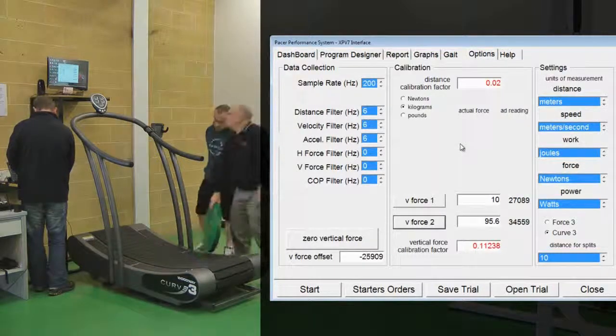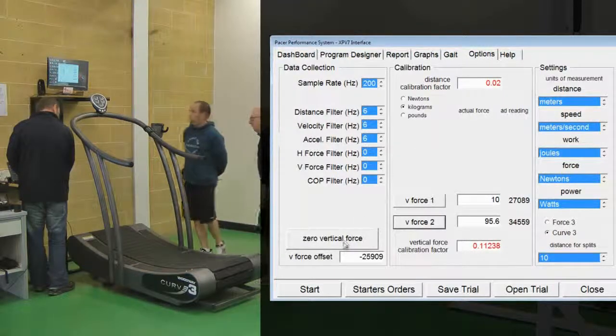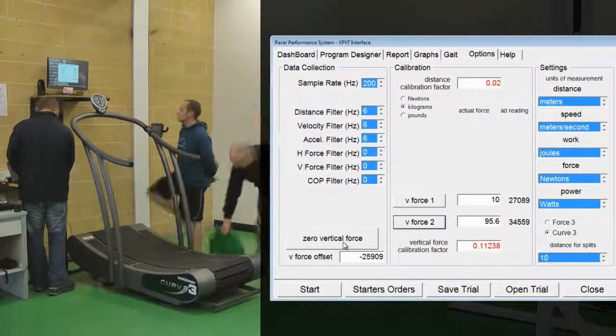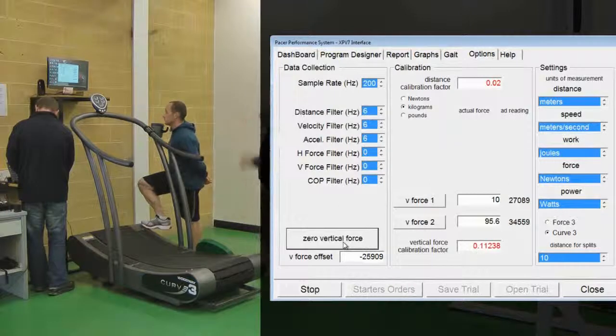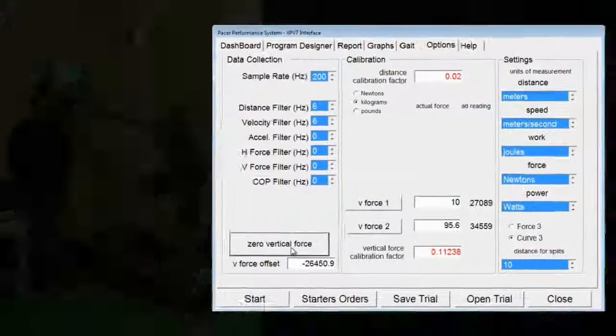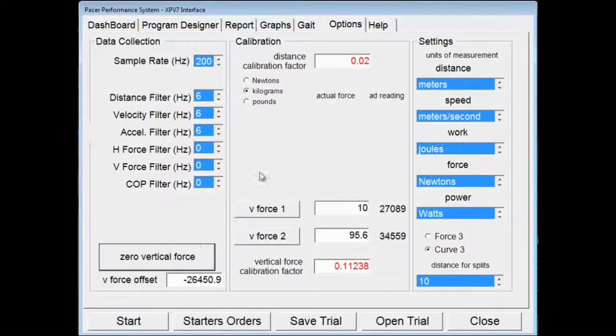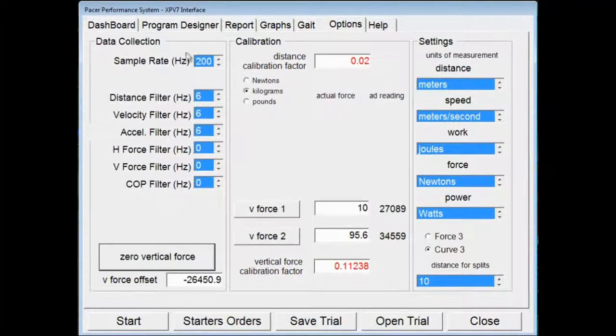And then remove all the weight from the treadmill, and click on Zero Vertical Force. And the treadmill is calibrated.